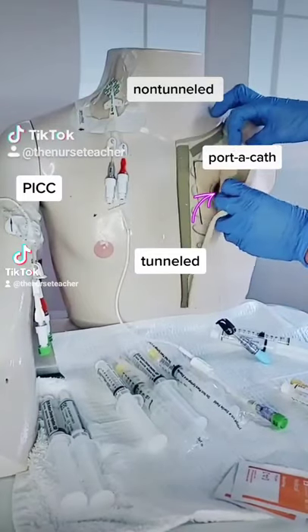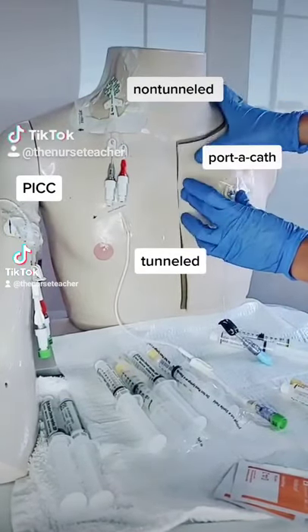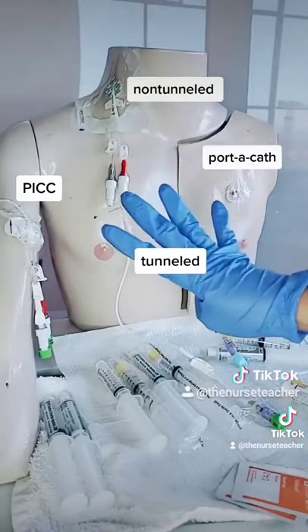If we peel back our patient's skin, we'll see that the port is surgically implanted underneath — please don't do that on a real patient. That's a single lumen.